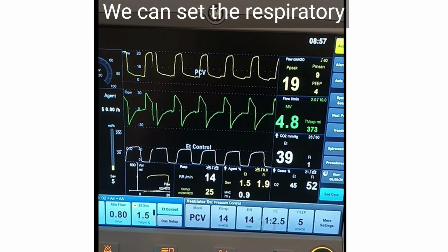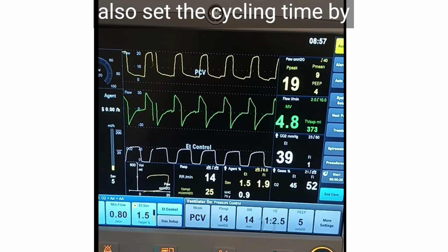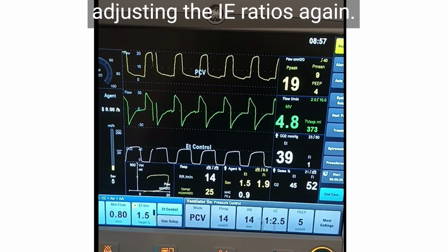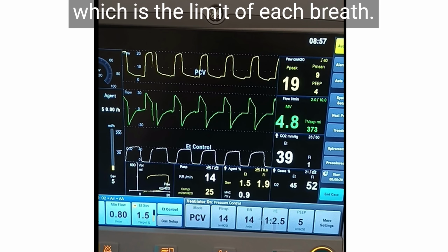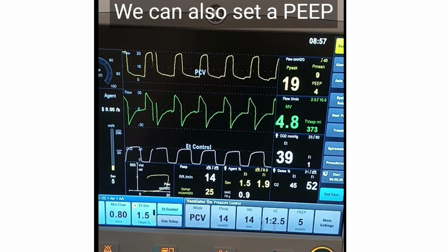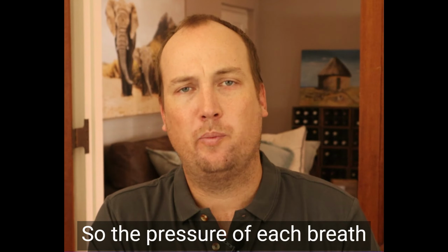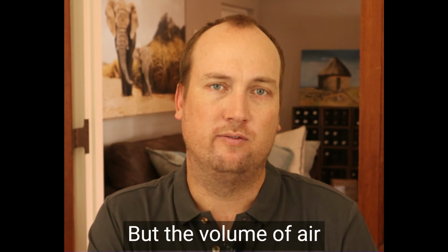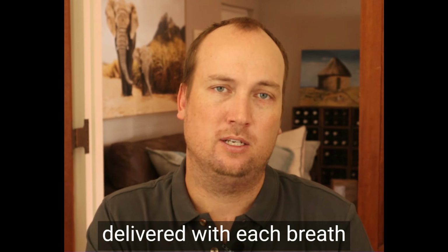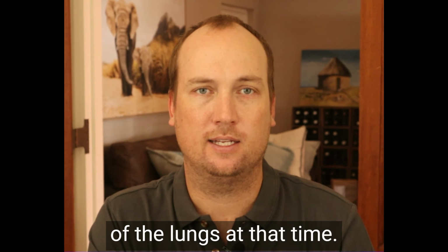We can set the respiratory rate again, and we can also set the cycling time by adjusting the IE ratios again. The main variable that we can adjust is the inspired pressure, which is the limit of each breath. We can also set a PEEP, and we'll again discuss PEEP a bit later in this video. So the pressure of each breath that we deliver is constant, but the volume of air delivered with each breath is variable, and it changes depending on the compliance of the lungs at that time.